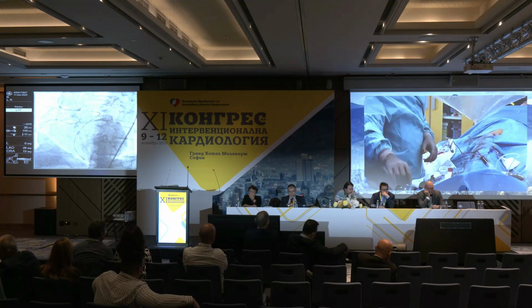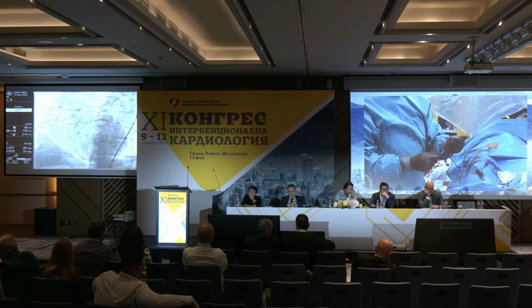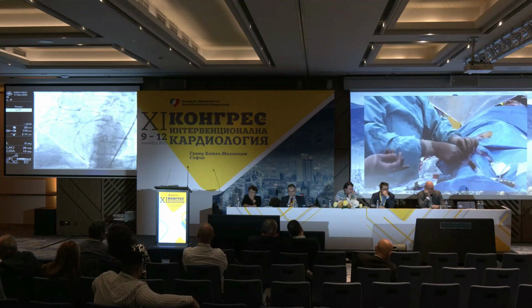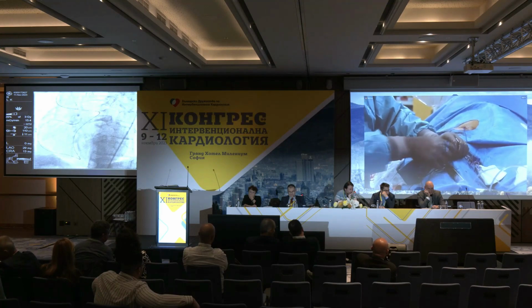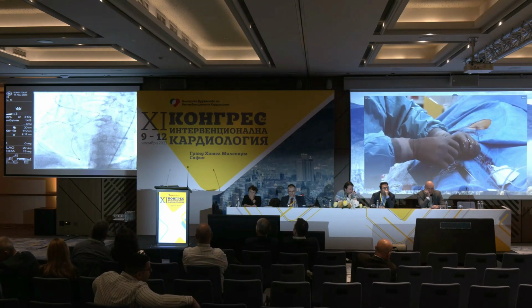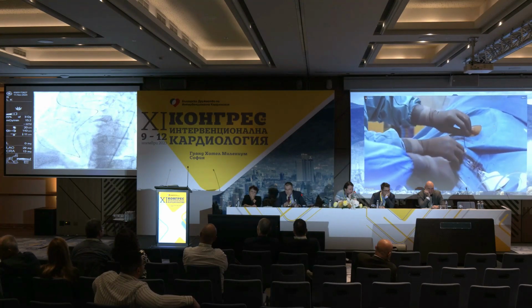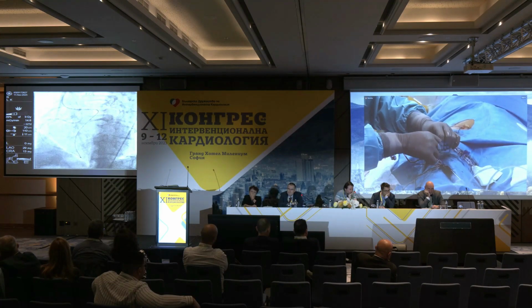No, don't do anything. Give me a wire. What we do mostly now, we take another wire and we put it around the sinuses, and essentially, as you will see, what does that is doing, because retrieving the retrograde microcatheter always carries the risk. So it goes to the left main. We don't want that. First of all, you see here we go to the sinus, and what does that mean? That if you try to push now the guiding into the left main, it is not possible. So essentially, you see it cannot go. That means that we are preventing the guiding catheter from entering the left main.